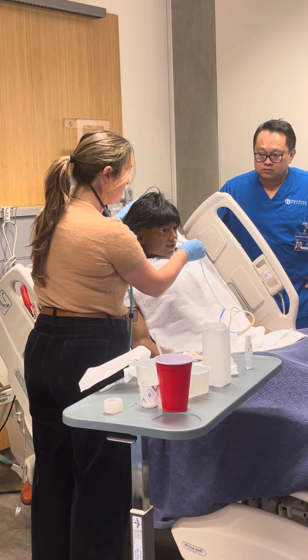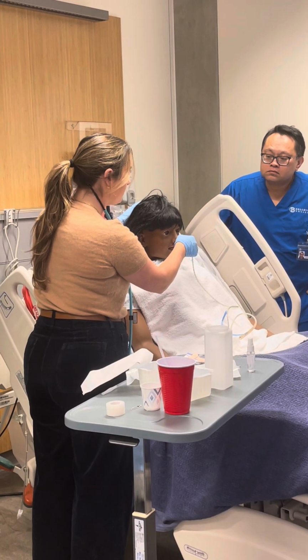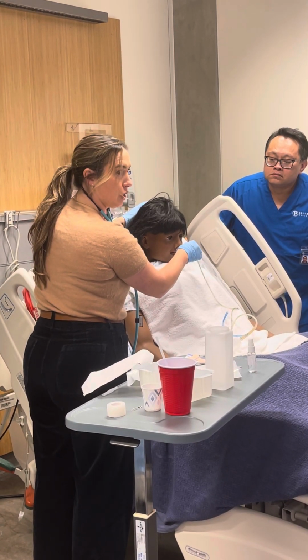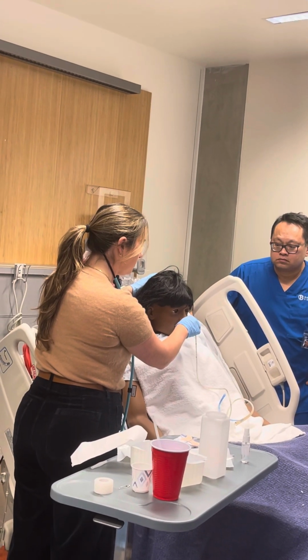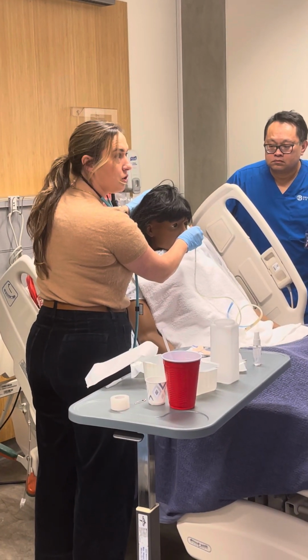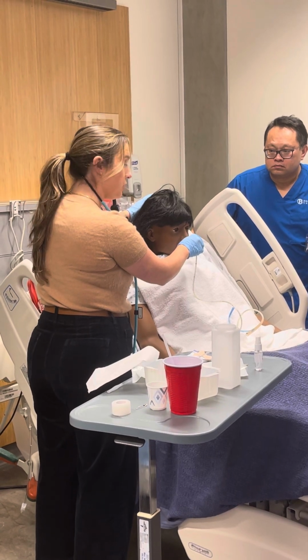Around here, you're going to start seeing the holes, and around 10, this is when you're going to start feeling it turn to go down through the nasopharynx. And around 20, this is when you're going to start getting to where their gag reflex is. You're going to start encouraging them, okay, I want you to swallow.